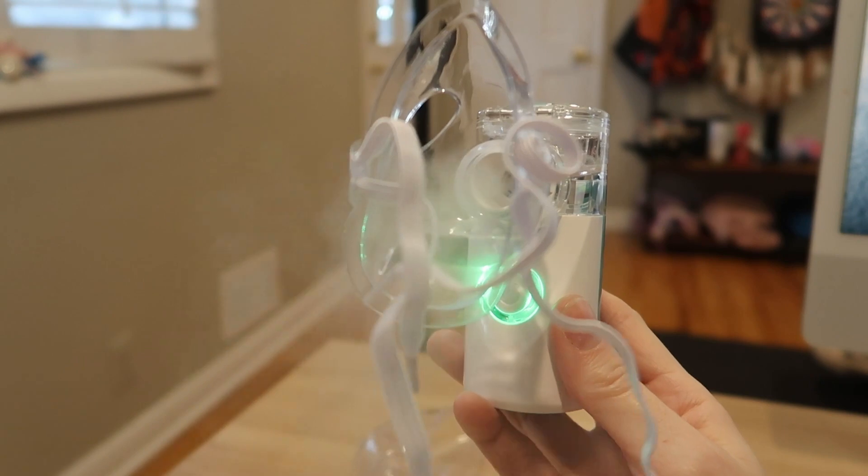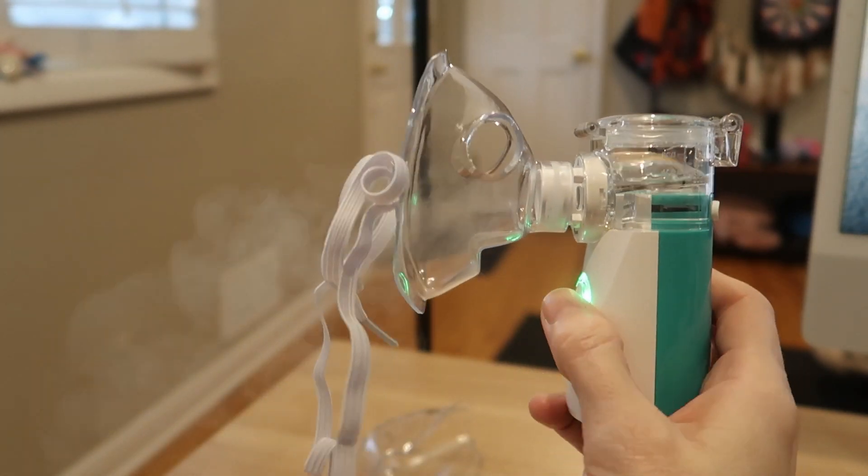Whether someone in your home has a chronic pulmonary disease, asthma, or you just need a nebulizer on hand for the occasional bronchitis or croup, this one is really easy to use. It's small, it's lightweight, it's good for kids and good for adults — you name it.